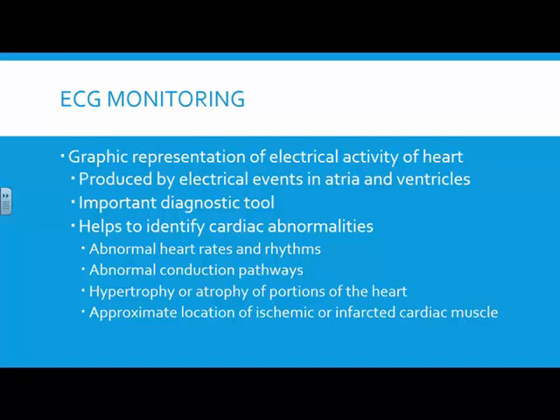So ECG monitoring helps identify cardiac abnormalities, heart rates and rhythms, abnormal conduction pathways, hypertrophy or atrophy of portions of the heart.